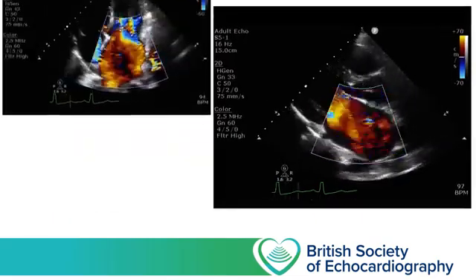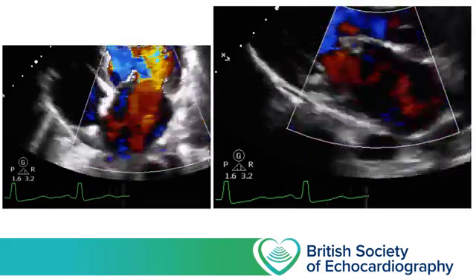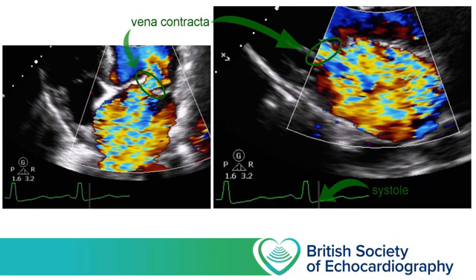The severity of the MR here is so great that it doesn't form a distinct jet like we've seen in some of the previous examples. Rather, it completely fills the entire LA cavity during systole. If you're ever uncertain whether you're seeing abnormal flow or not, pause your clip and advance frame by frame, paying attention to which phase of a cardiac cycle the flow is occurring.